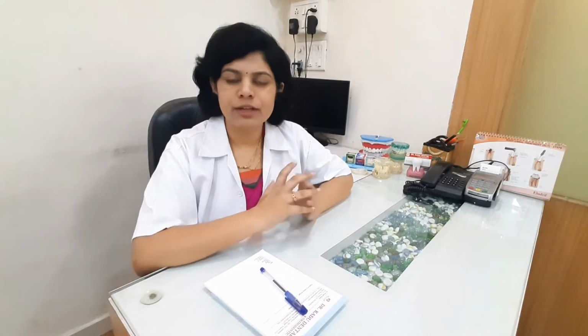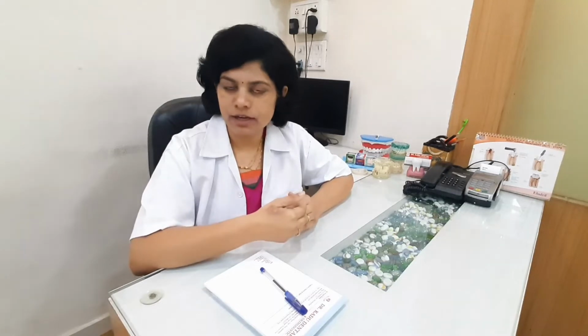So first, when the patient comes to us, the first preliminary checkup we do is a detailed intraoral examination. We check your gum health. We check the amount of bone which is available at the site where we have to put the implant. How many teeth are missing? We take the measurements of your teeth and photographs of your teeth. In some cases, we will take x-rays also. In some cases, a CBCT scan of the jaw will be advised.